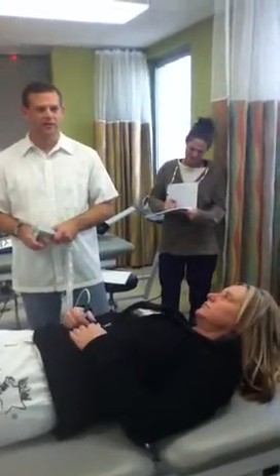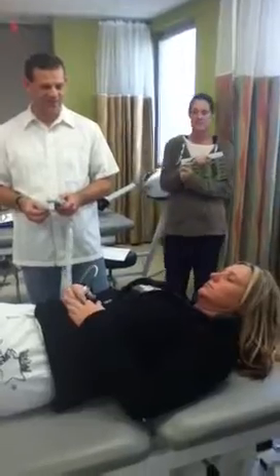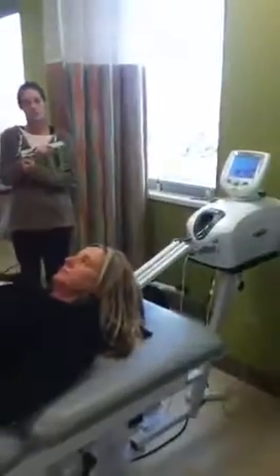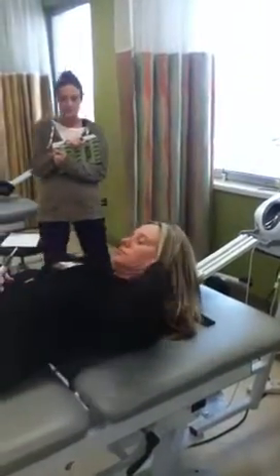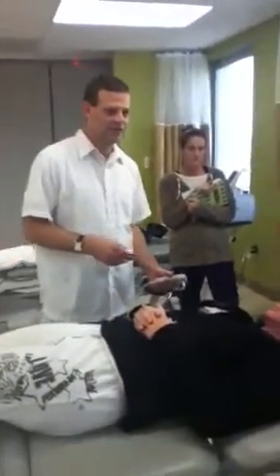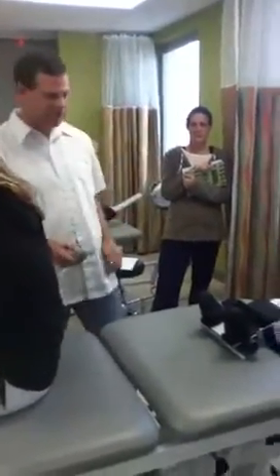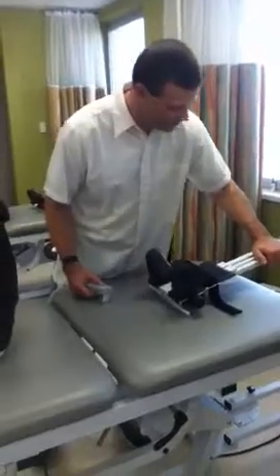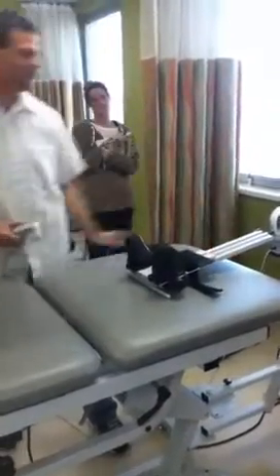So what do we want to do with Ms. Mitzi? Are we going to angle her or do neutral? Well, you had your car wreck — is your neck issue upper or lower? Notice that when I start raising this thing up, it started pushing back into the machine and now it's going to come out. I'll usually have them sit first. So if you don't mind sitting up for a second — that's the worst way to set someone up because their neck hurts. Do you want that to be perfectly straight? I want it pretty straight. It doesn't look straight.